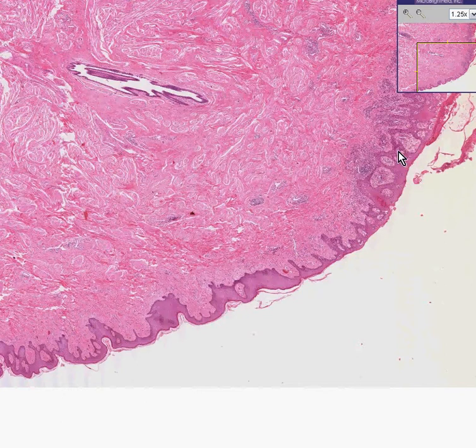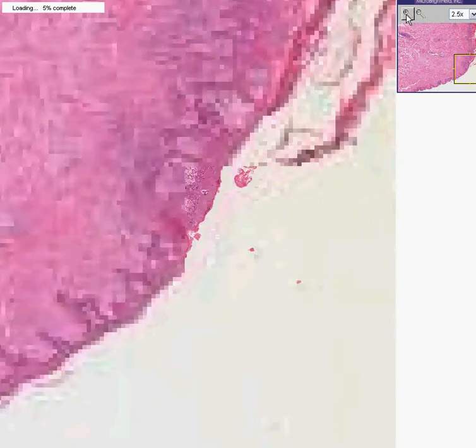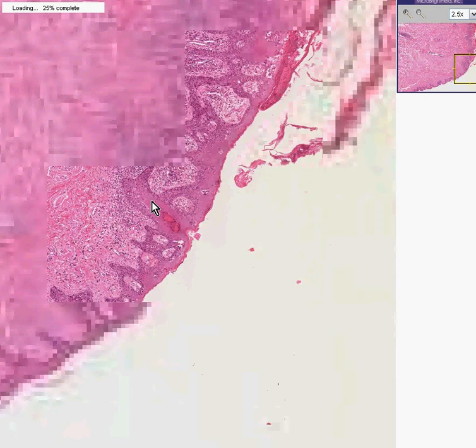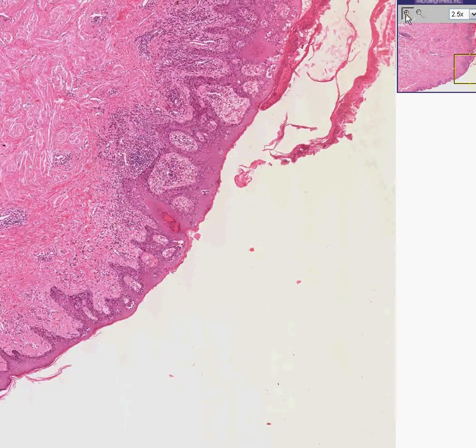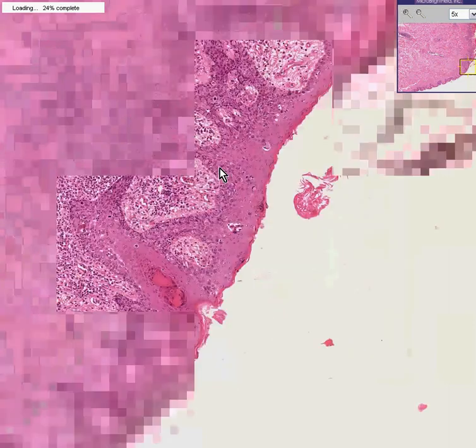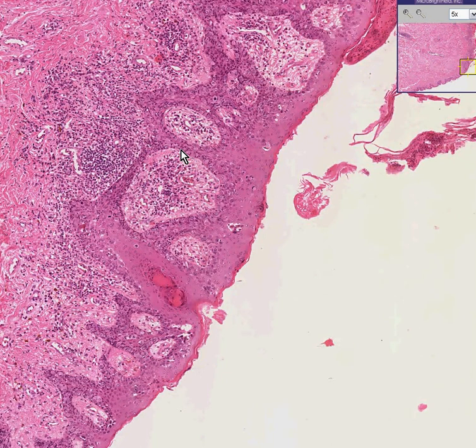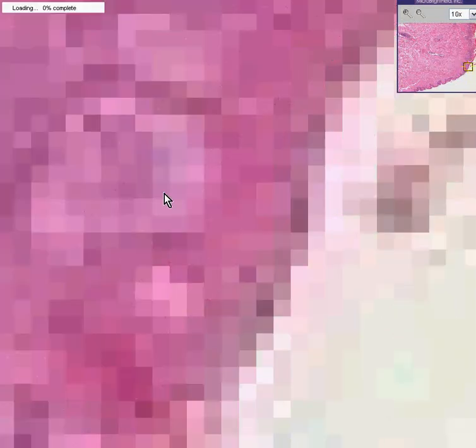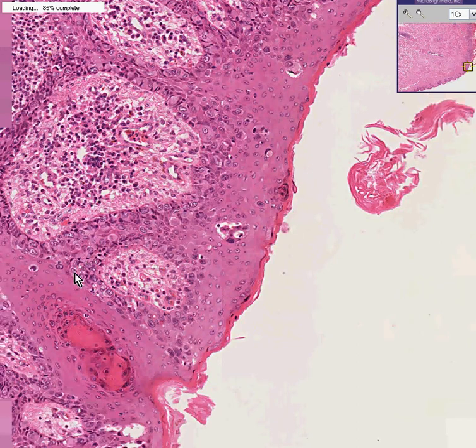But the thing I would like to really point out is that besides that, you can see that if you look at the base of the cell, you're going to see some cells which don't look like they belong there. And even from this power, if you look, it looks like a lot of these cells in the basal layer are abnormally ballooned — like here, like here, like here, like here, like here.